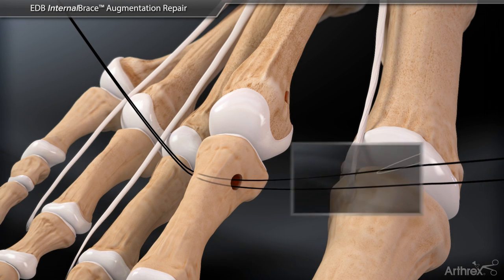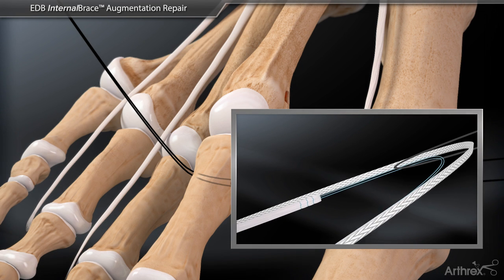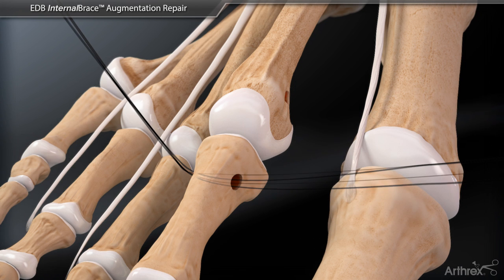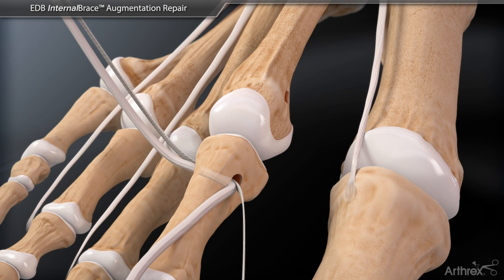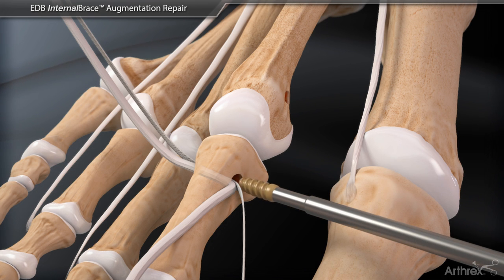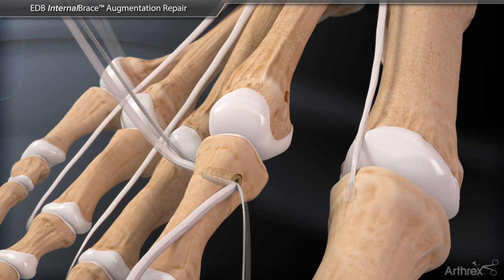Using the nitinol suture passing wire, the whip stitched extensor digitorum brevis tendon and labral tape suture are passed through the proximal phalanx from medial to lateral and pulled to adequate tension. A 3 by 8 mm peak tenodesis screw is inserted medially to initially set the tension in the proximal phalanx.